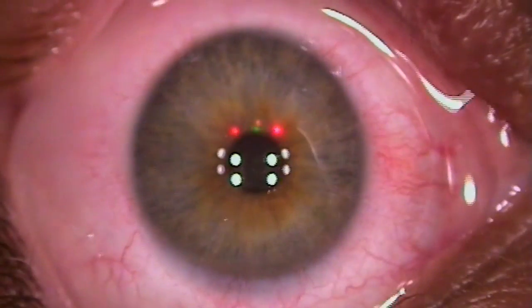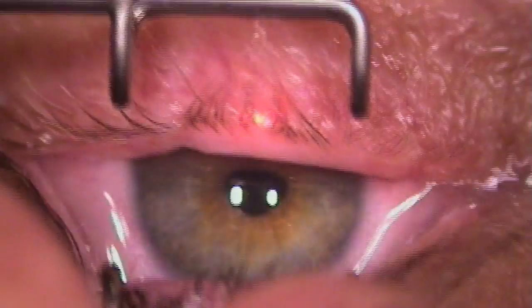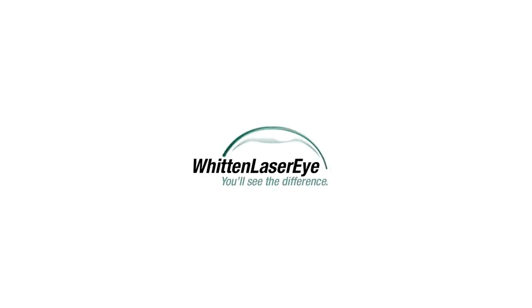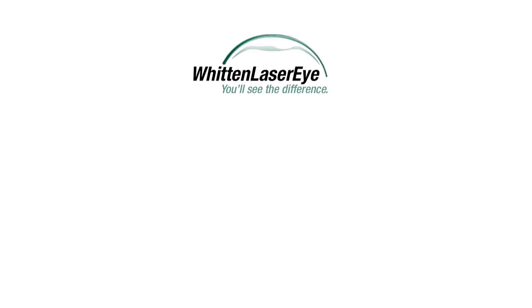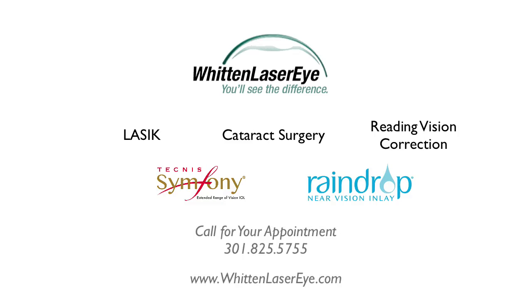A couple of extra numbing drops, some antibiotics here. Well done — you're good.